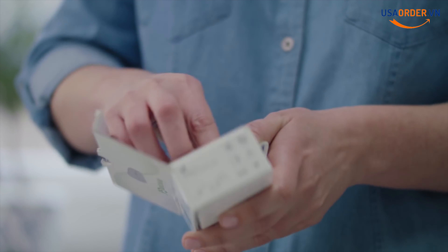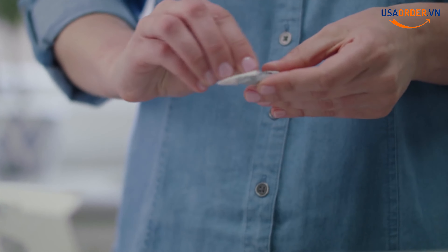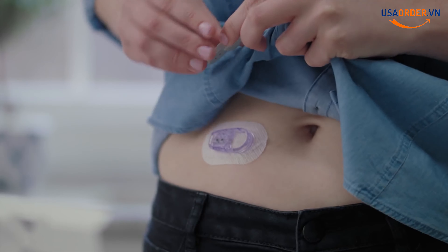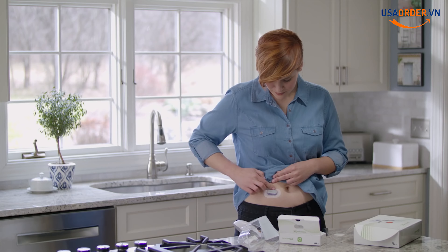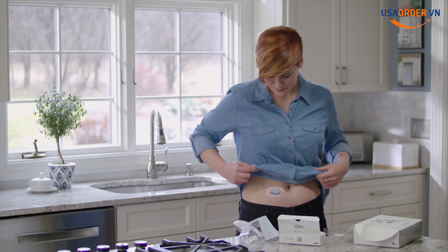You'll wear each sensor for 10 days. Now it's time to attach your transmitter. Take your transmitter out of the box. Clean your transmitter with alcohol and let it dry. Insert the tab of the transmitter into the slot on the transmitter holder. Snap the transmitter firmly into place. Rub around the patch three times. You've successfully attached your transmitter.